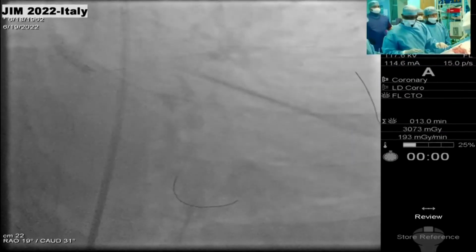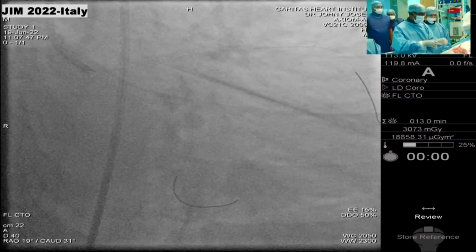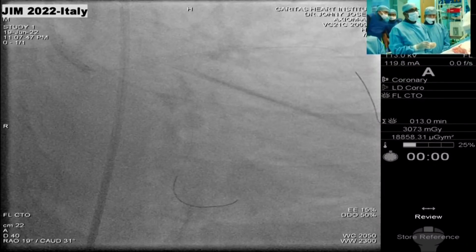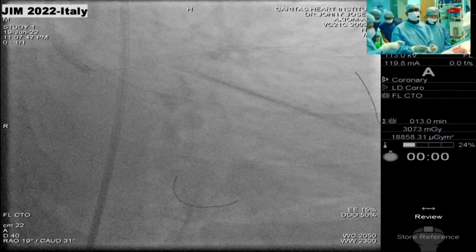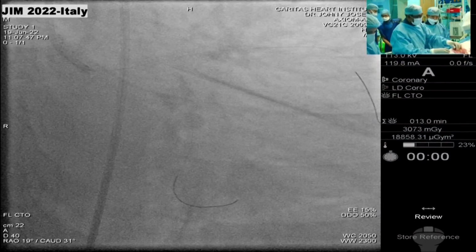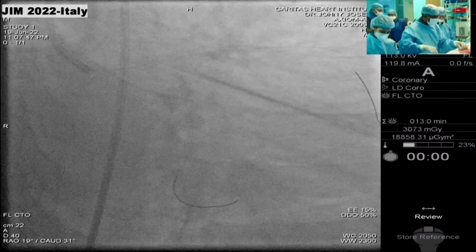Yeah, I think I would like you to give me an OCT of the circumflex because I like to see the mid lesion also. Yeah, see, the only thing Dr. Davidson, what we can do there is, too many things we're asking you. Well, going with OCT without dilating, that will be a challenge, George. Let's see. And anyway, first to do the mid LAD has not been done with high pressure balloon dilatation. So don't forget that the occlusion was in the mid LAD. So that needs the special attention.